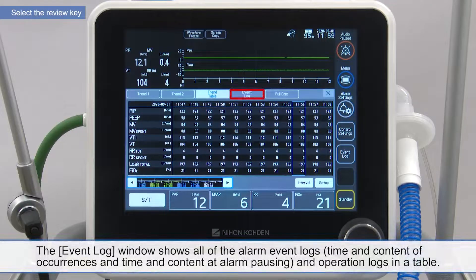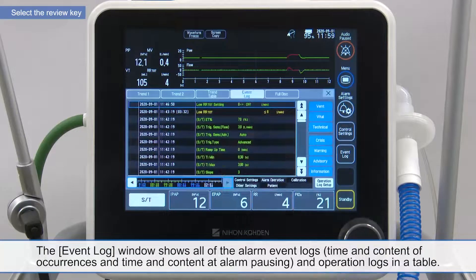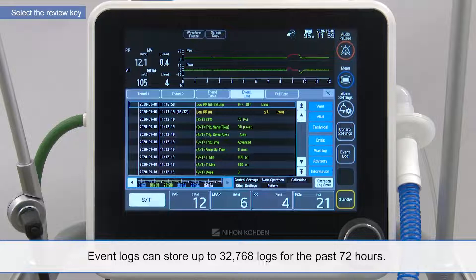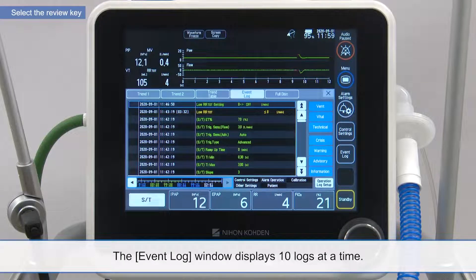The event log window shows all the alarm event logs and operation logs in a table. Event logs can store up to 32,768 logs for the past 72 hours. The event log window displays 10 logs at a time.